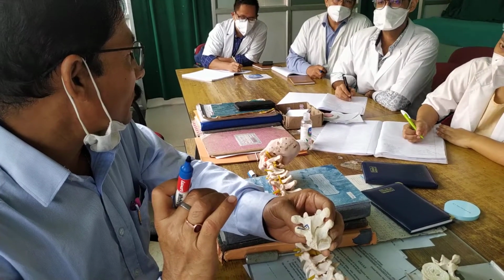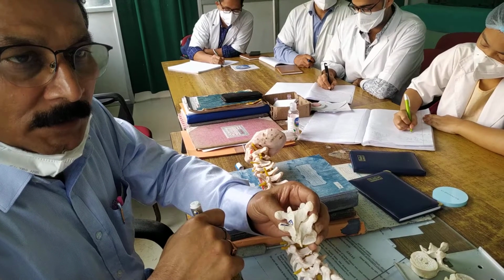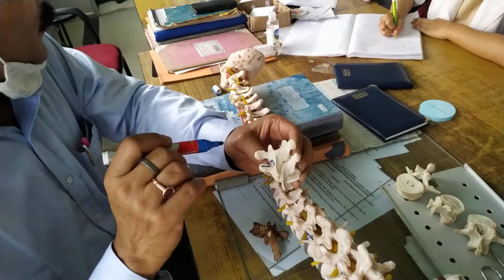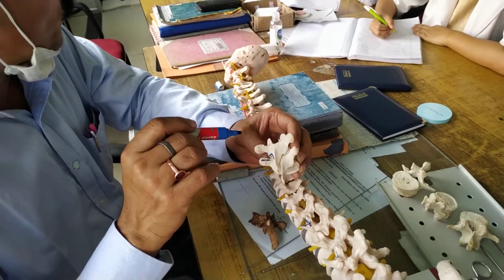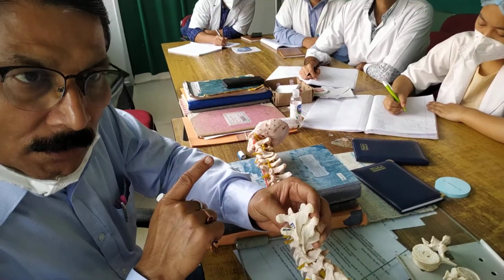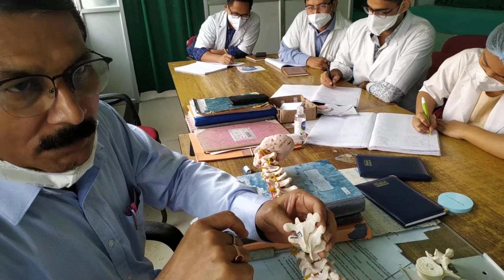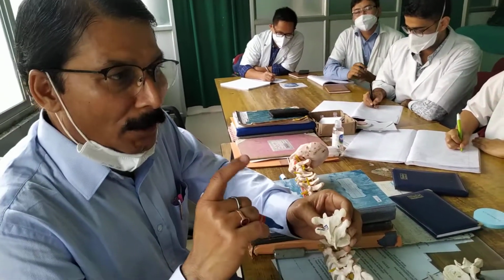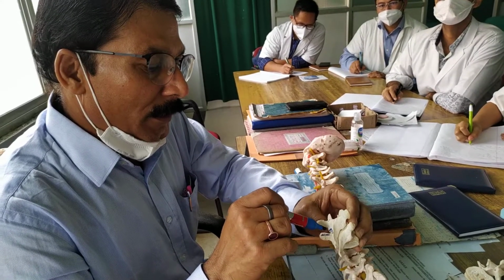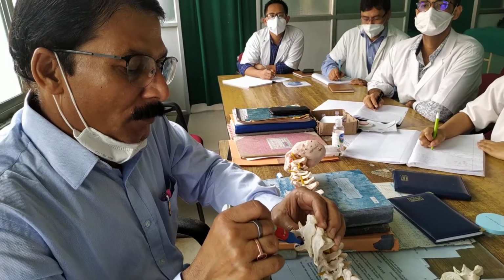Upper 1/3, middle 1/3 and lower 1/3. Okay, sir? So now the point is that the line joining the upper 1/3 and the lower 2/3 is an important line for us. The line dividing the upper 1/3 from your lower 2/3 is the important line.